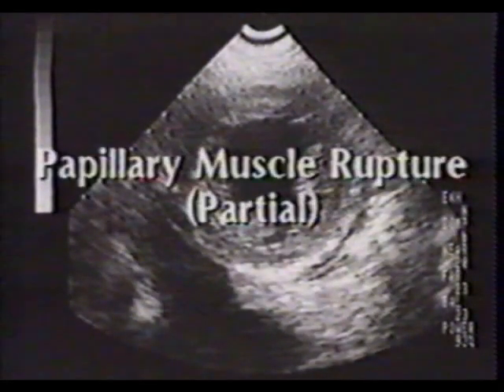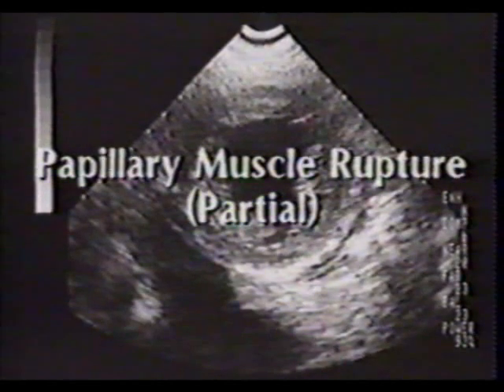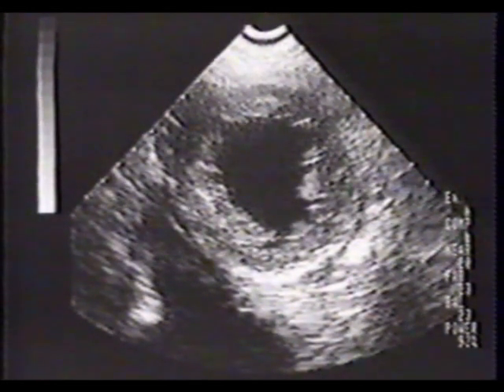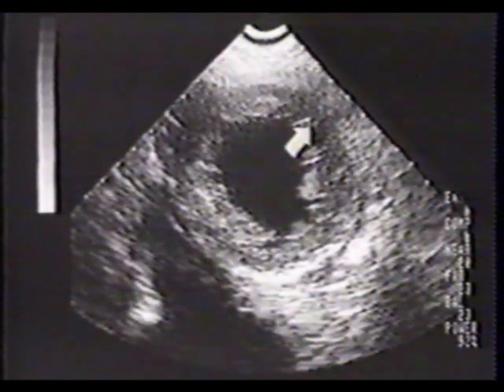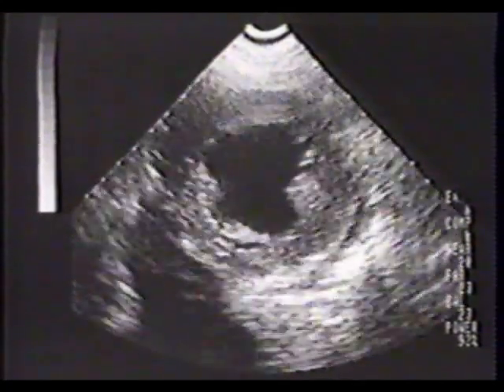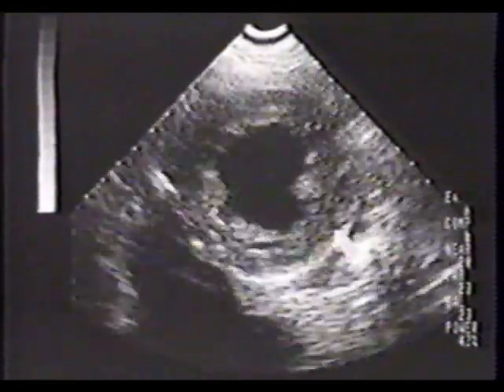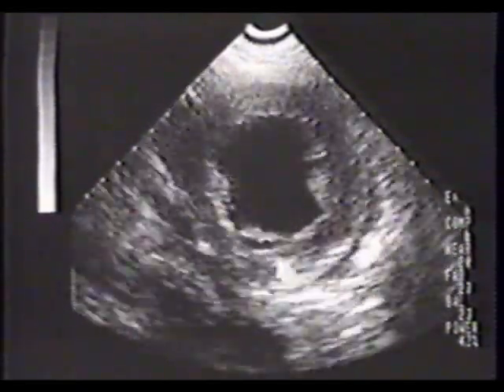This is a peristernal short-axis view of the left ventricle at a level near the base of the anterolateral and posteromedial papillary muscles. The patient has suffered an acute inferolateral infarct. This is pleural effusion. In real time, you will see that the septum and anterior wall are hyperdynamic. The inferior and lateral walls have not thinned, but they are akinetic.